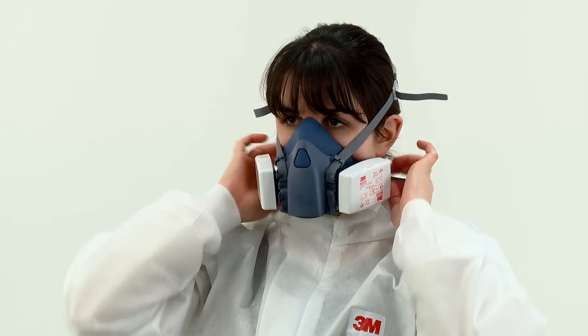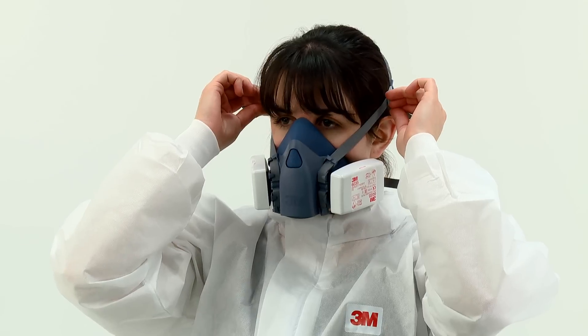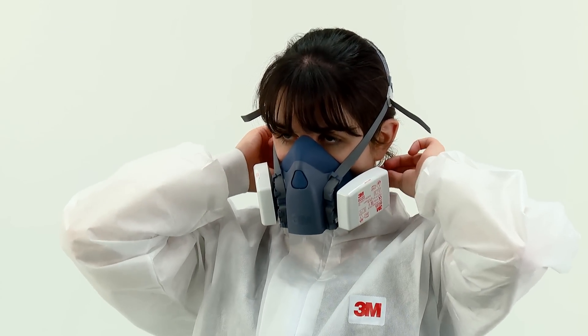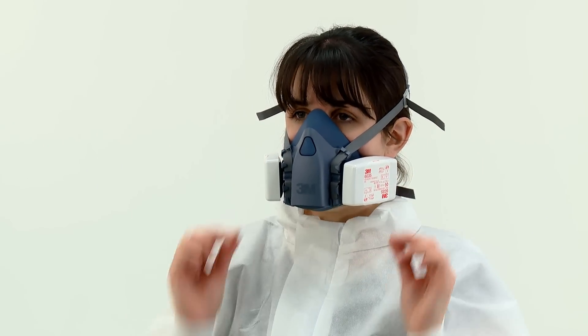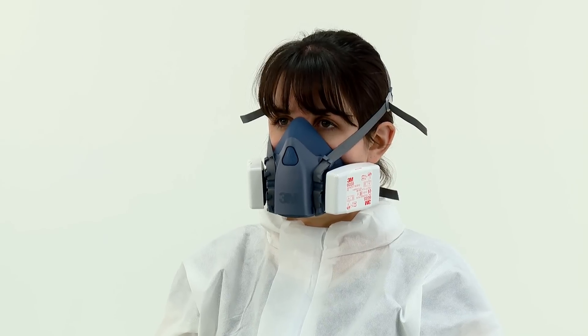Ensure the straps have not become twisted. Tighten the top head harness first by pulling on the ends of the straps to achieve a comfortable and secure fit. Tighten the bottom straps in a similar manner to secure the respirator. It should feel snug against your face, but take care not to over tighten. Strap tension can be decreased by pushing out on the back of the buckles.